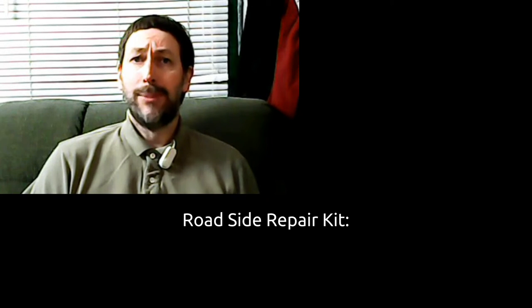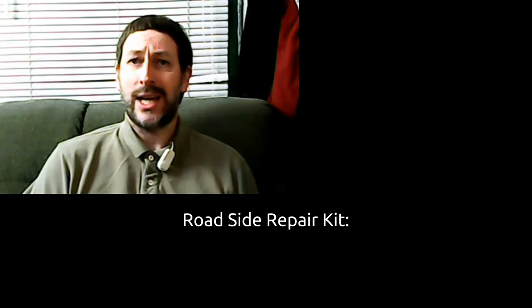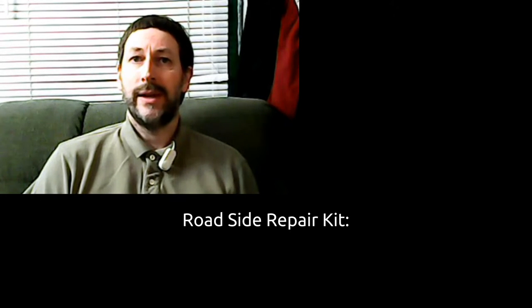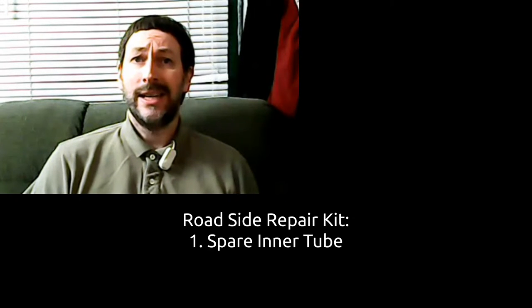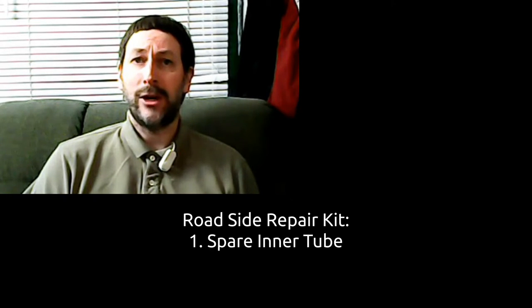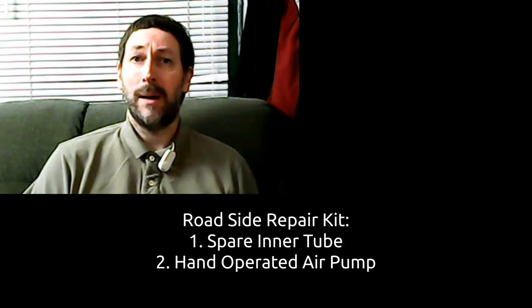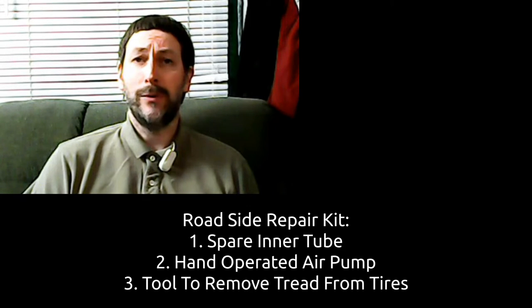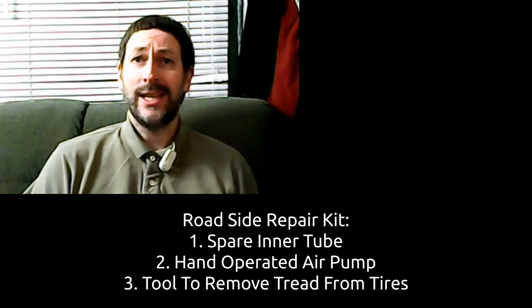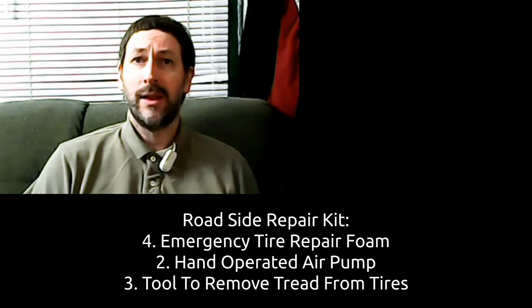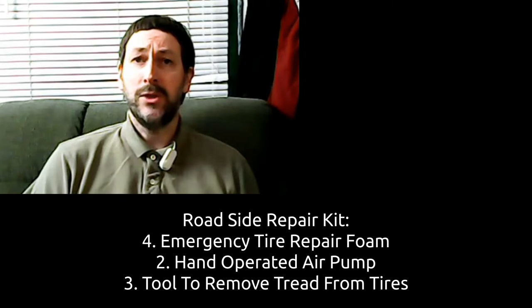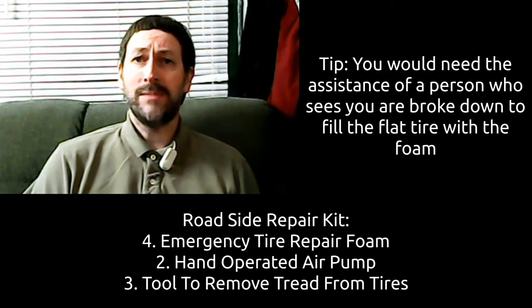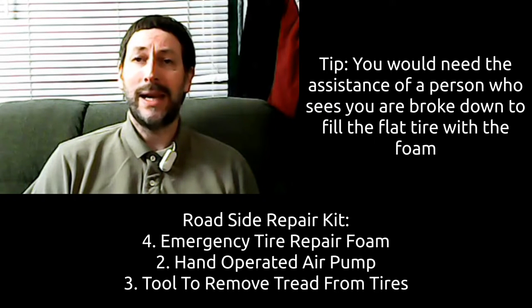Step three, put together the following roadside repair kit. It should contain a spare inner tube if you have air-based tires, a hand-operated air pump, a tool to remove tread from tires, the same idea as what's used for a bicycle. Emergency tire repair foam. This may provide temporary means of inflating a tire in order to get you home and out of the elements such as extreme heat or cold.